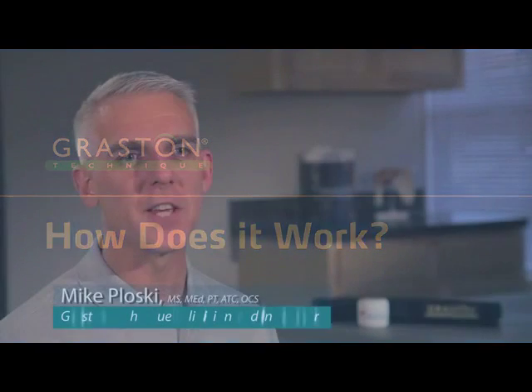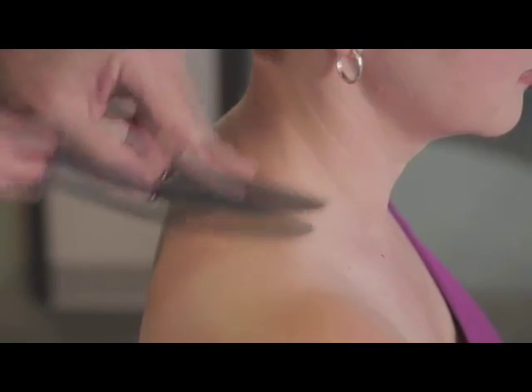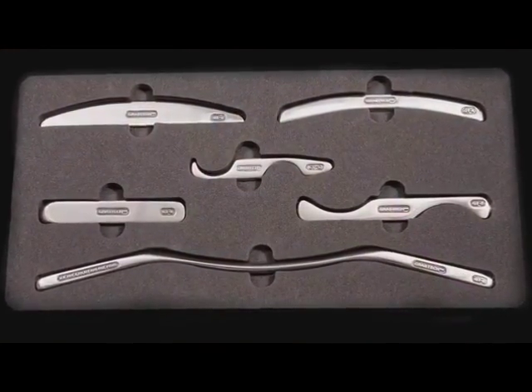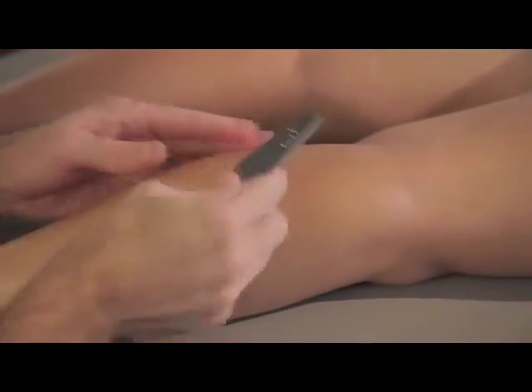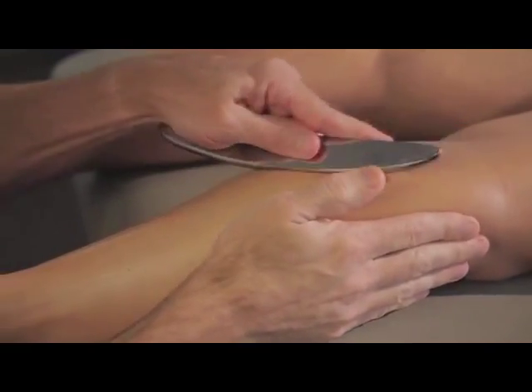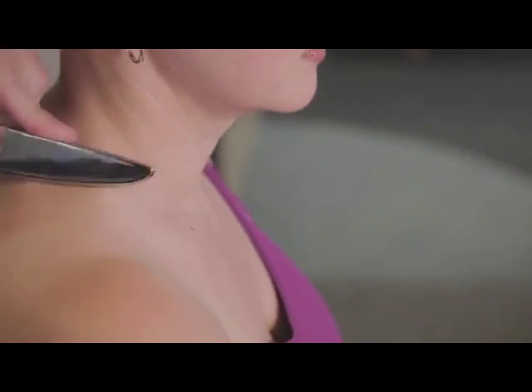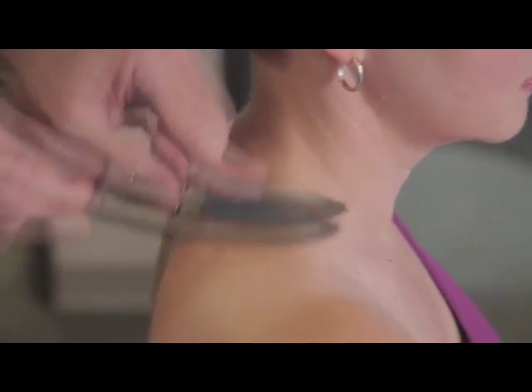Graston technique is a unique method of instrument-assisted soft tissue mobilization where we use stainless steel instruments to assess and treat soft tissue dysfunction. The instruments are made of a very dense stainless steel, so as the clinician glides the instruments across the tissue, the abnormal tissue texture will actually be amplified through the instruments into the clinician's hands. So the clinicians are still using their hands, they are just using an instrument between their hands and the tissue to again amplify that abnormal tissue texture.